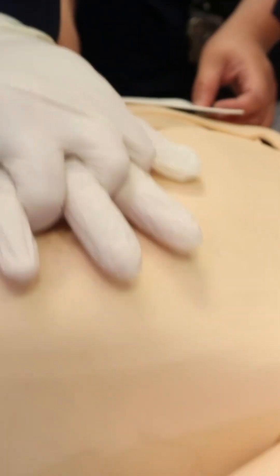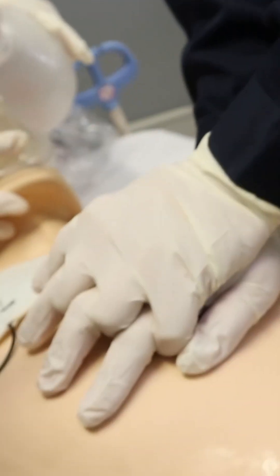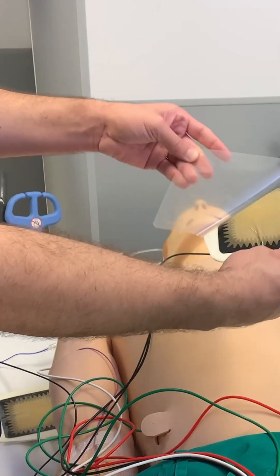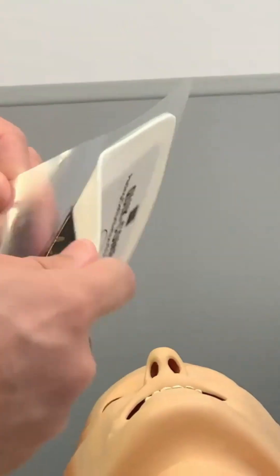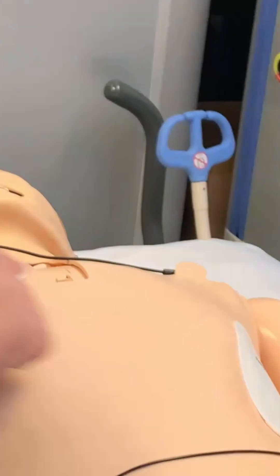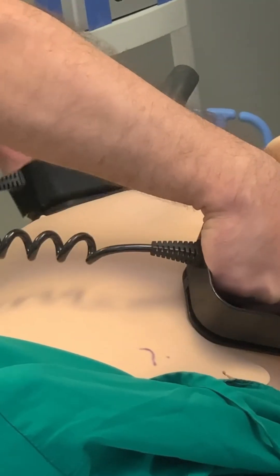AHA recommends 360 J if you are using the monophasic and 200 J if you are using the biphasic. Self-adhesive defibrillation pads are more effective than paddles because they decrease transthoracic resistance, which enhances the effectiveness of the shock. The pads can be placed anterior-lateral or anterior-posterior, as shown in the picture on the pads. If you are using paddles, use gel.